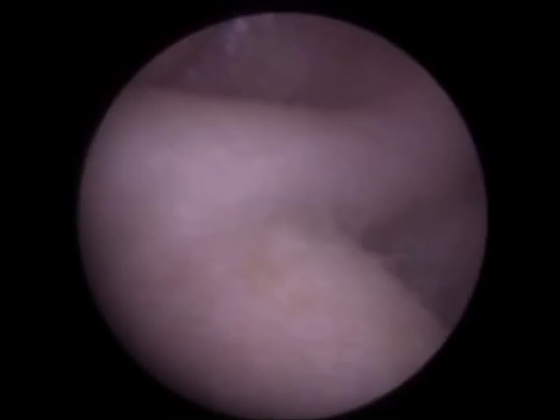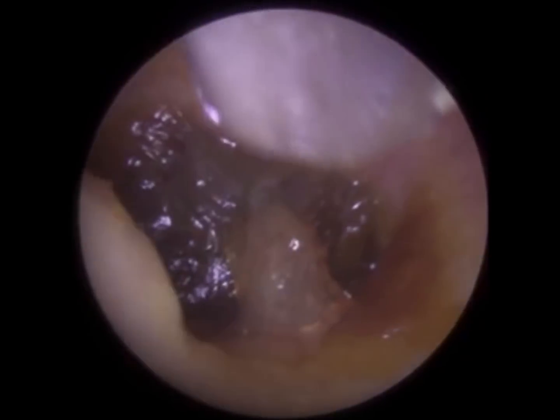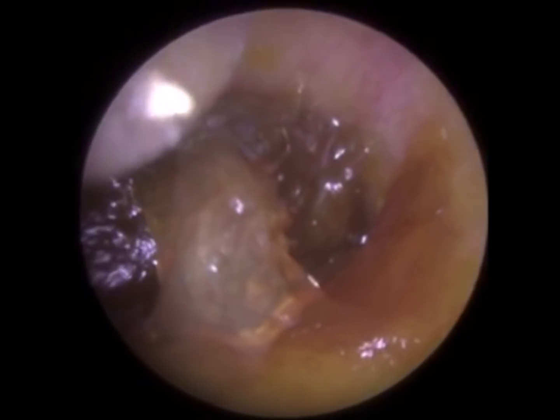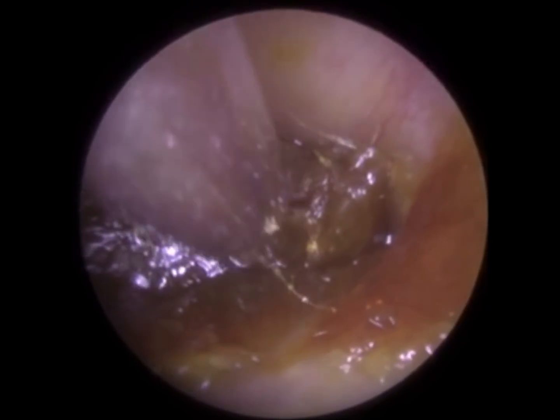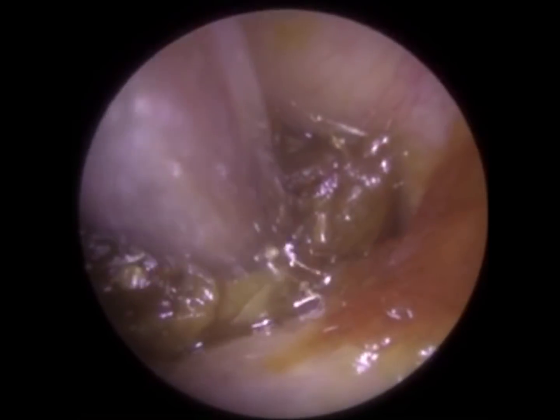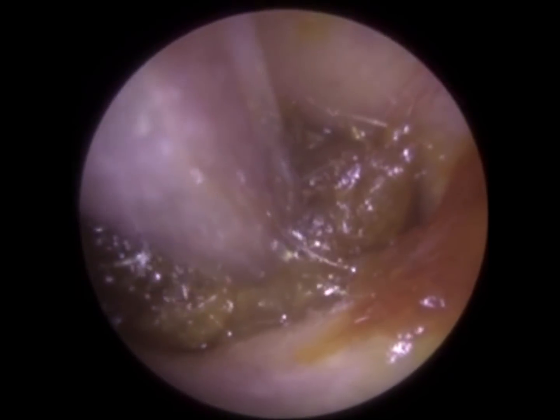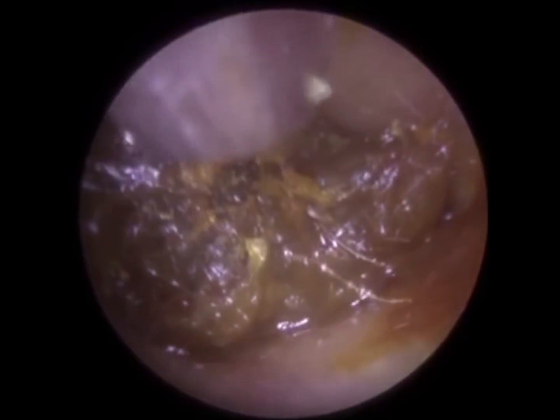And last but not least, this is the third client. So this client had used a smart swab. It's one of those spirally devices that I've seen on Amazon and on Facebook. It's like a corkscrew, and they just push the wax further in the ear. It's really impacted on the eardrum. I think they also caused some bruising to the ear canal. You will see that a bit later on the anterior canal wall.